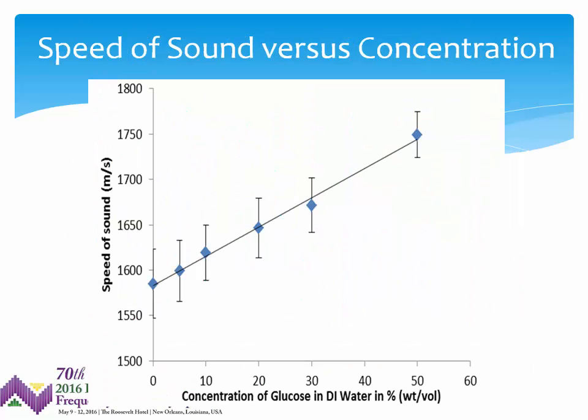And you can then infer from those measurements effectively the speed of sound in the medium, which over this fairly wide range of concentrations does track linearly with concentration.